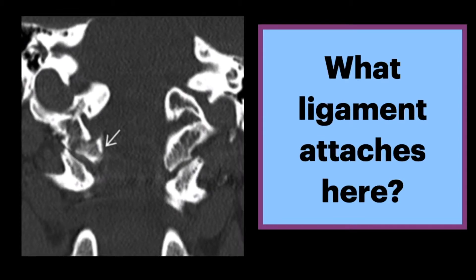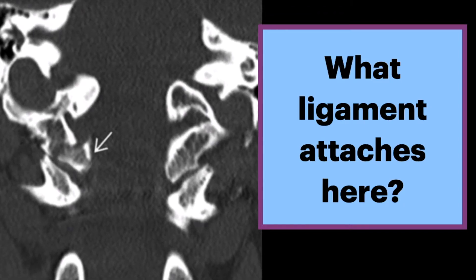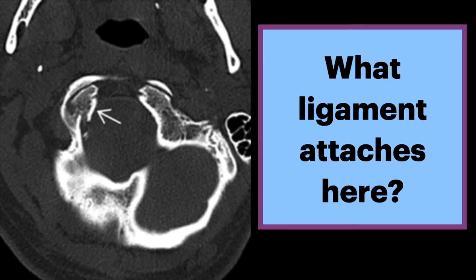What ligament attaches here is indicated by the straight arrow. This coronal CT of the upper cervical spine shows a mildly displaced fracture of the inferior and medial aspect of the right occipital condyle. An axial slice shows this mildly displaced fracture again.